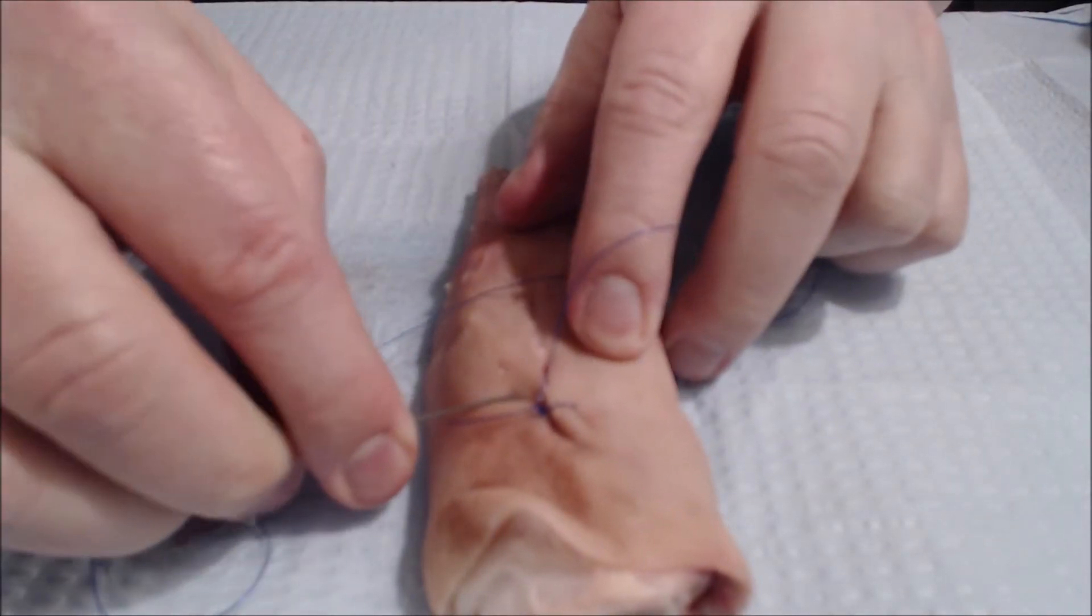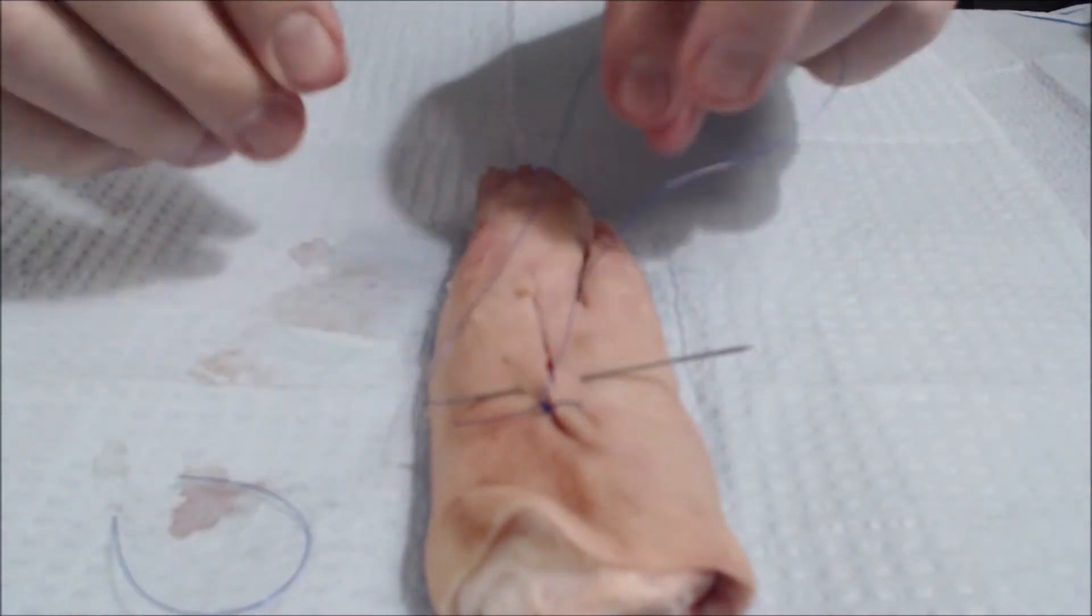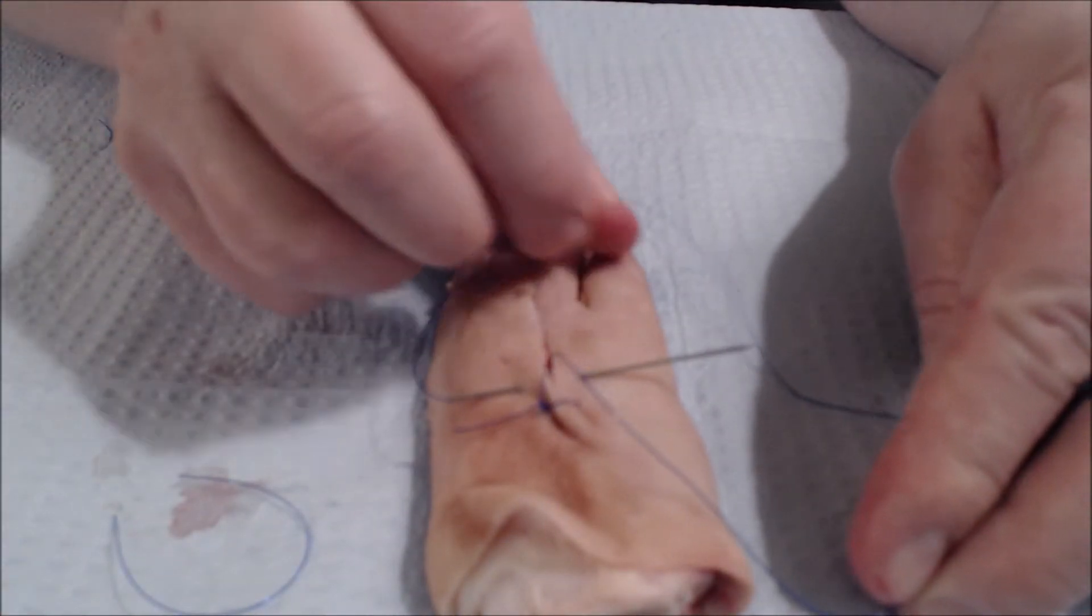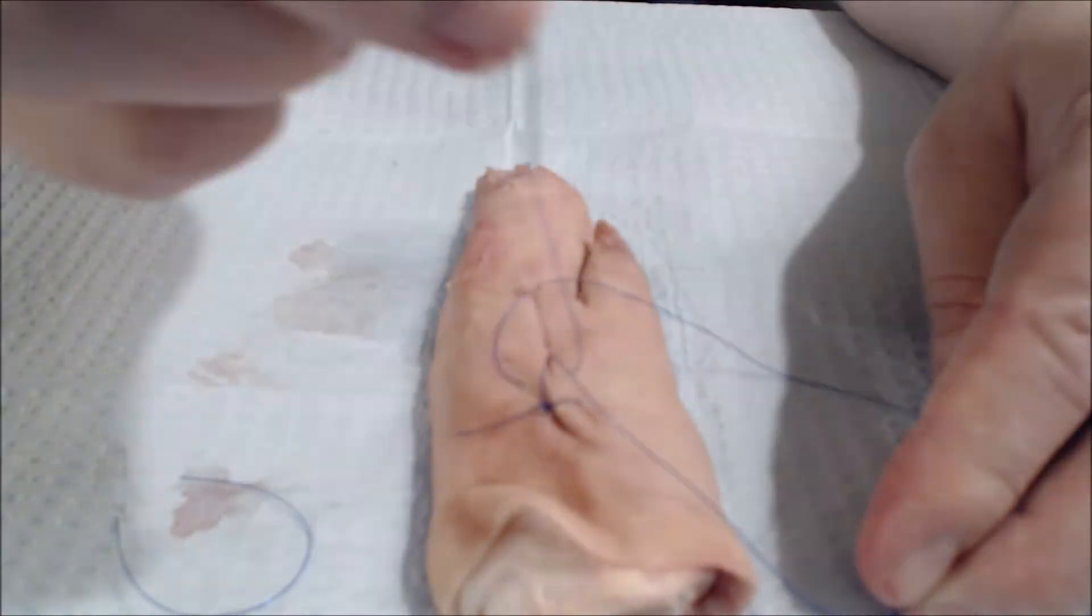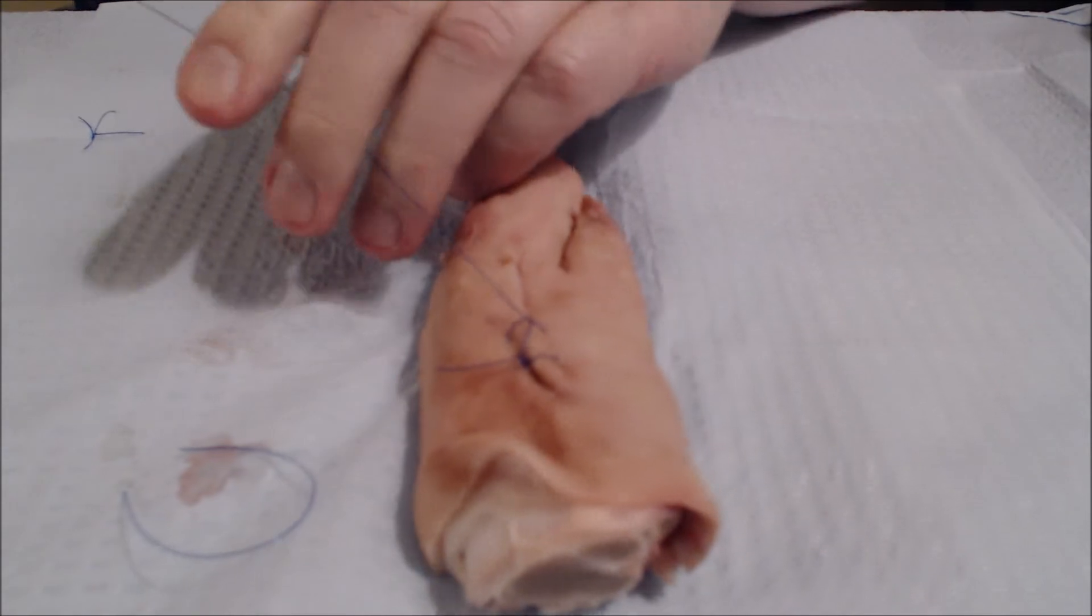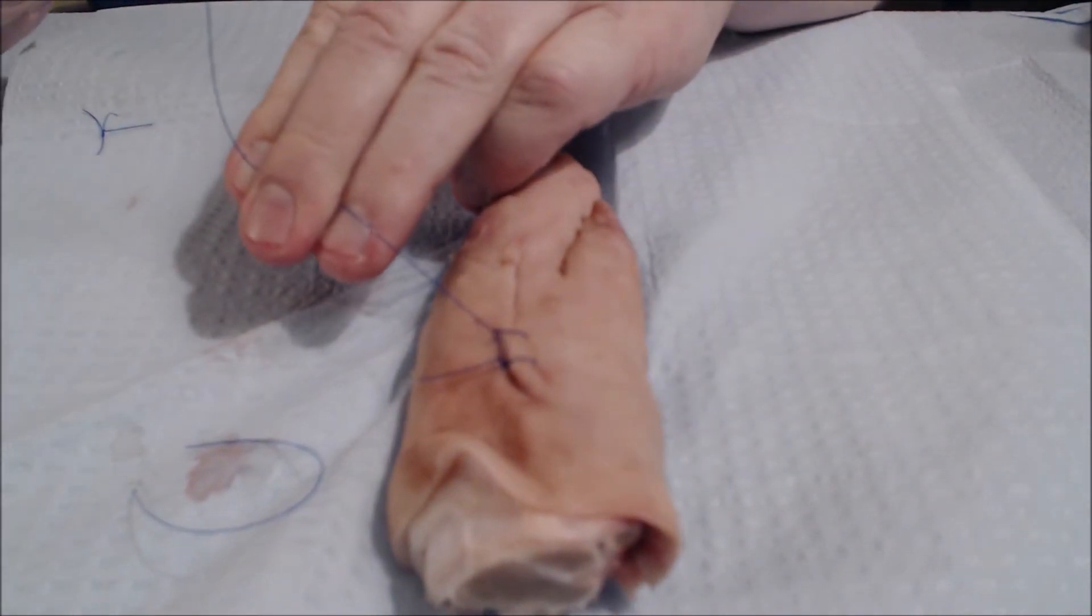Place the suture through, but the trick here is I'm going to loop the suture around and pull the needle out through the center of it. And watch what happens. It locks like that.